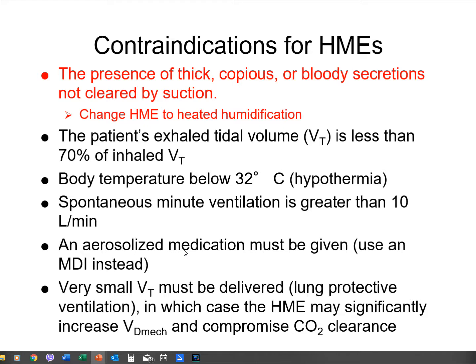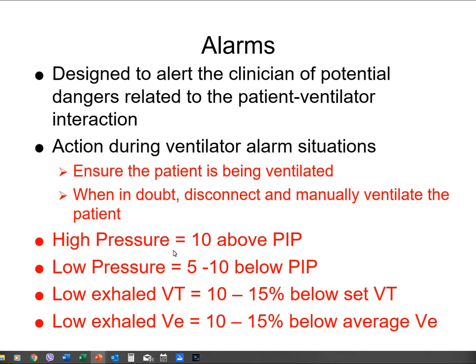It was really cool. But I think those ones are pretty expensive, so you probably won't see those at clinicals. So you might just see the normal ones, like the blue ones, or you might have the white one, it's a lot thicker, and then it'll have like a yellowish sponge inside. Okay, so again, with HMEs, just make sure that it's not blocking the whole HME, so that no airflow can go in. Just watch those.